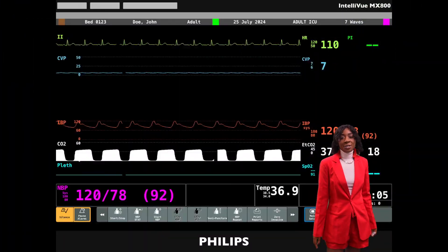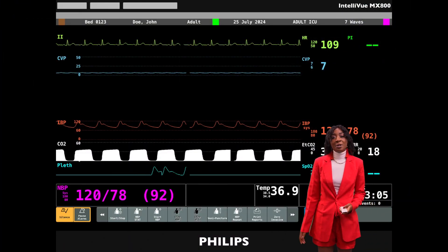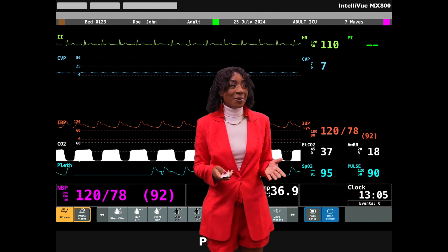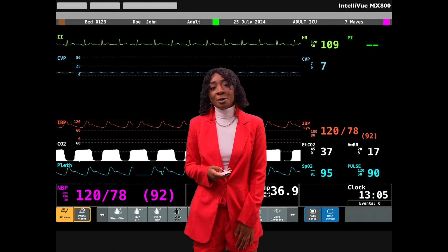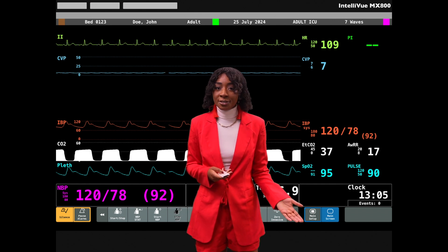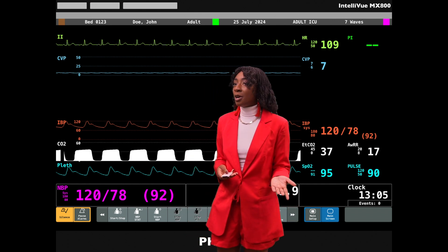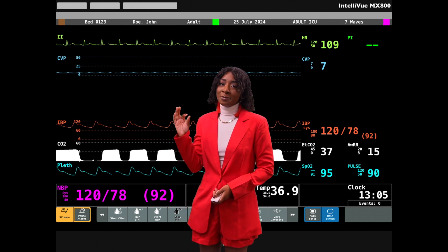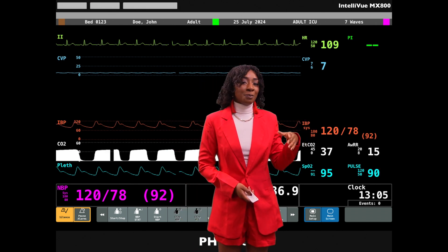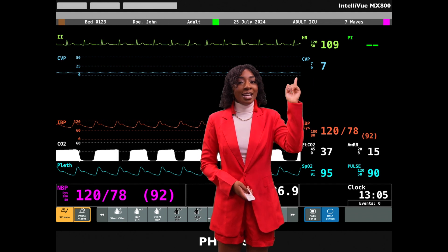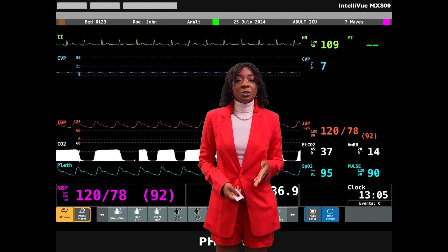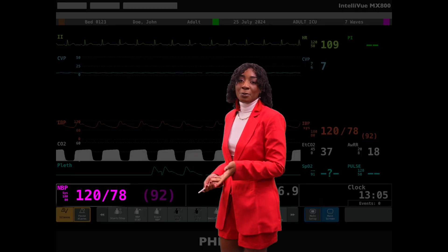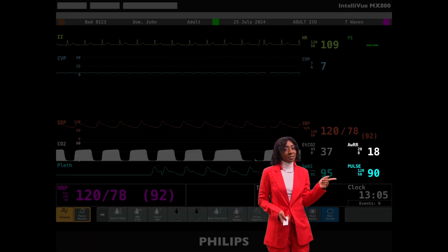I'll first give you the general layout of the monitor. When you enter a patient's room, you will likely encounter something like this. Unfortunately, the positions and colors of the parameters are not standardized, so you may get variation from monitor to monitor. The labels for the different vitals can be quite small, so it's important to look at both the number and the tracing. In general, you'll see the heart rate at the top, blood pressure at the bottom, and your pulse ox and respiratory rate are usually in the middle.